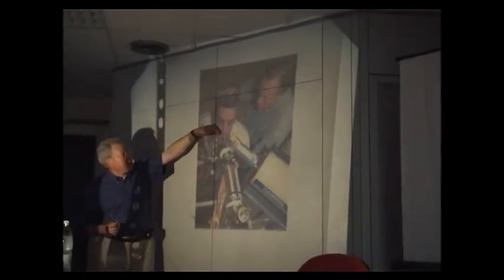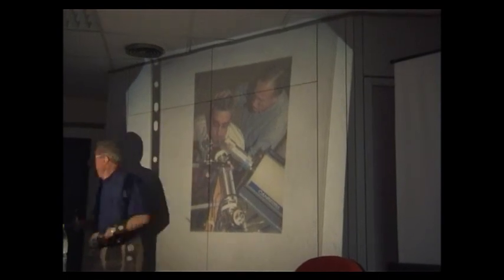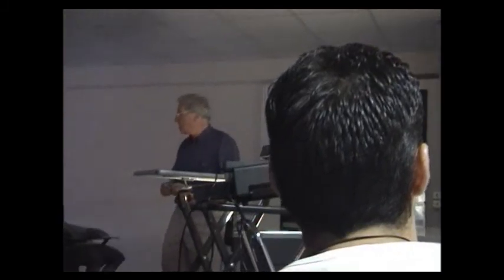We irradiate the tooth of the person directly in the mouth. And you see here the tube of the accelerator, the people in place, the gamma ray detector in order to check the presence of fluorine.